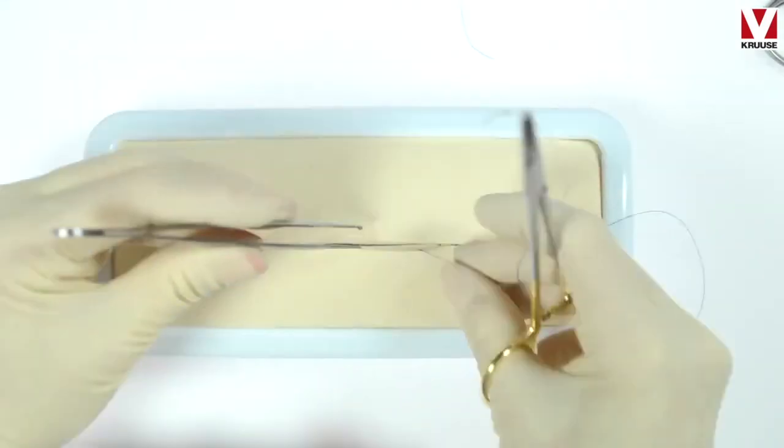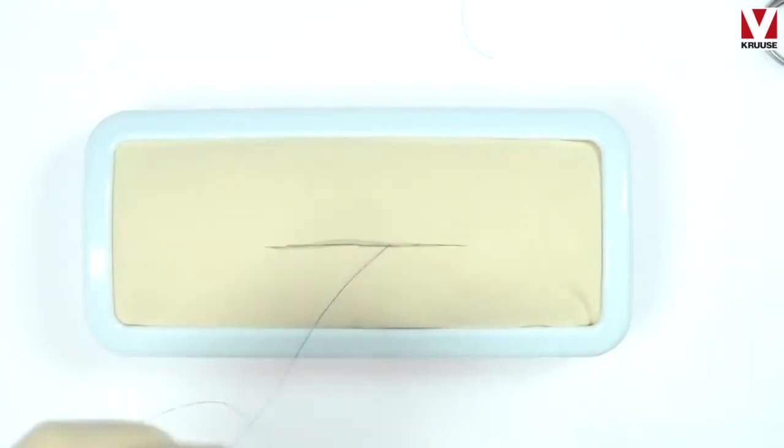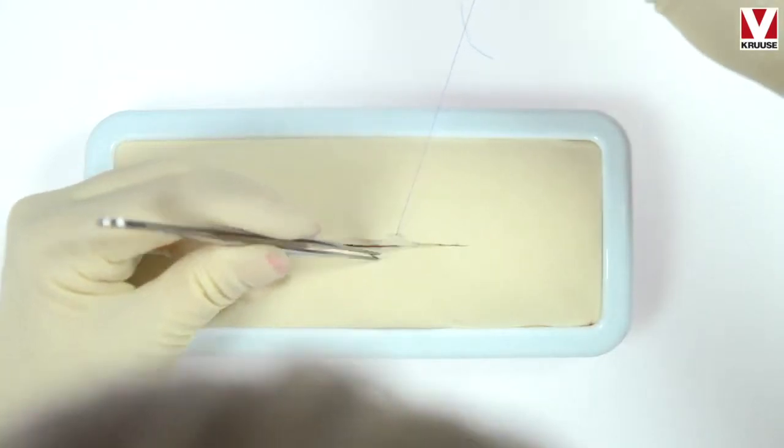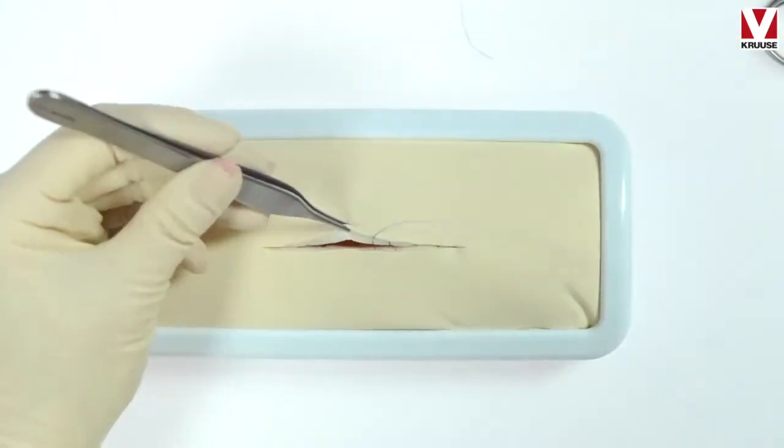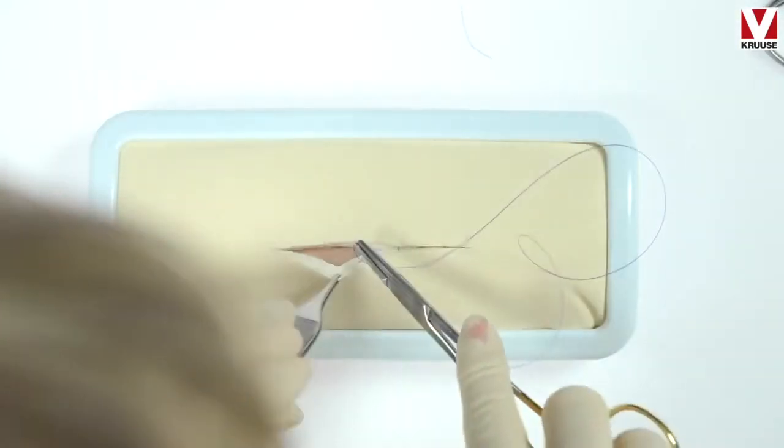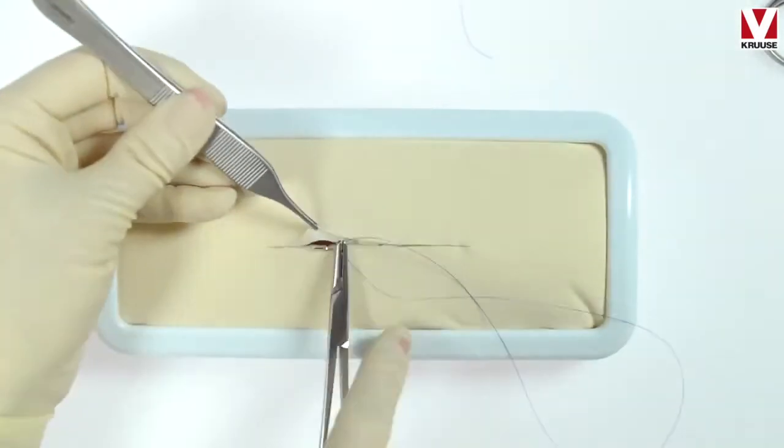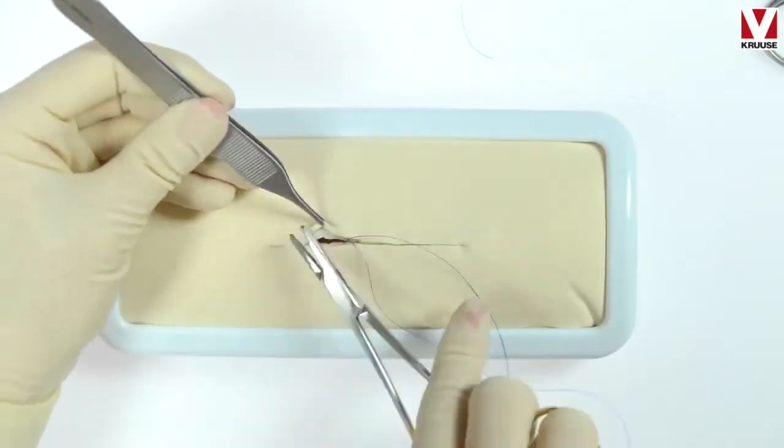So here we go with the continuous pattern. We start on one side and then to the next side. And it is very important that you just cross the incision and you don't go back. So the bite you take on the opposite side has to be perpendicular to the suture that came out on the other side.